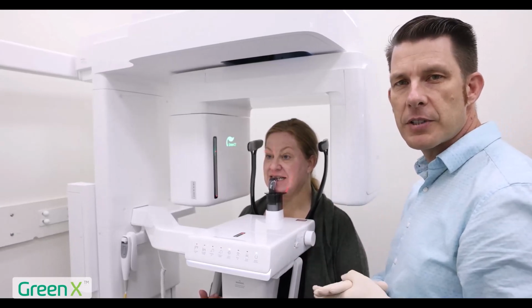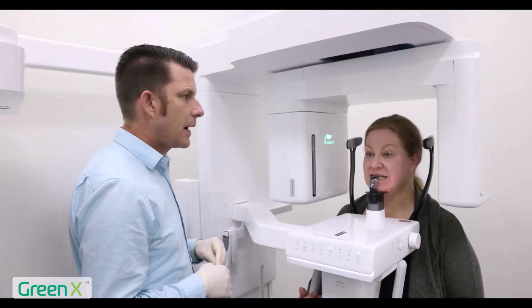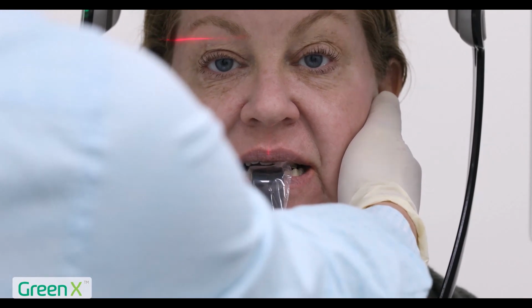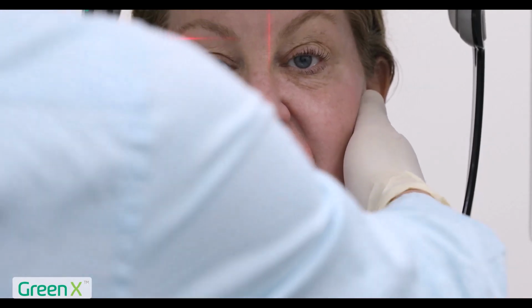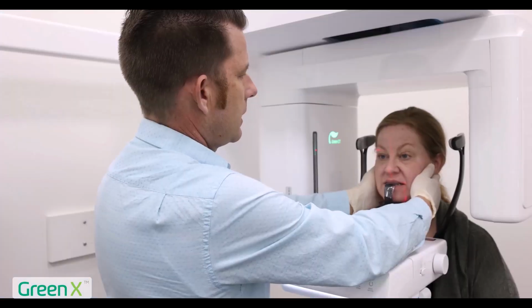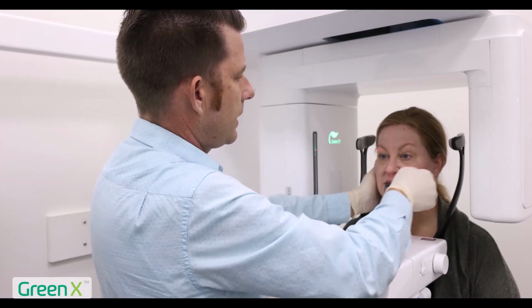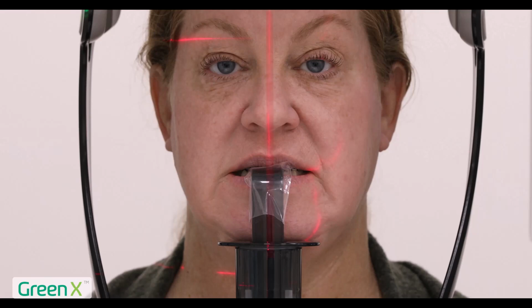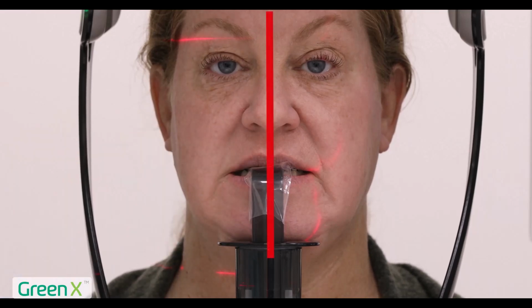Once I have the patient in the device, I'm then going to work with my positioning beams to make sure they are properly positioned. So first I want to start with my mid-sagittal beam, and I'm going to have the patient gently open and gently close on the bite stick. We're going to get you there. Perfect. I have my patient right on the bite stick. I can see my mid-sagittal beam right between the eyes and right through the philtrum.